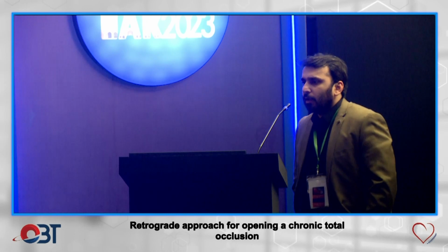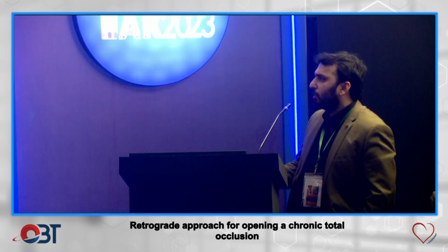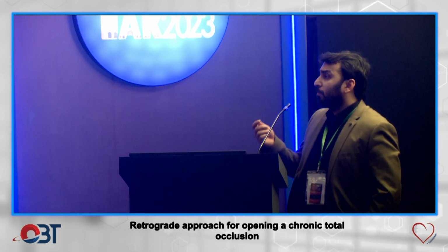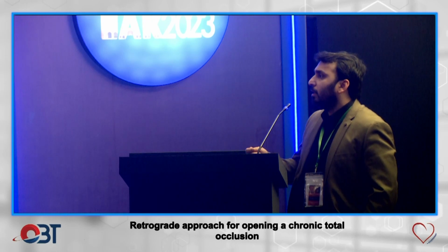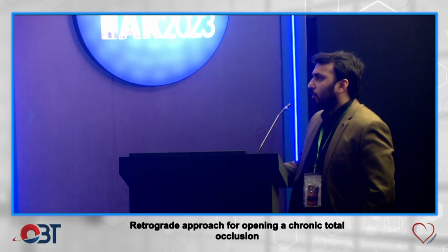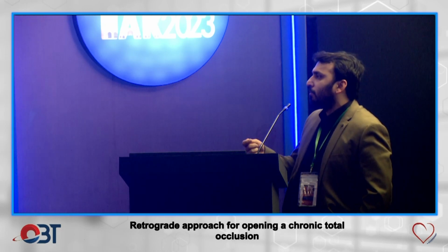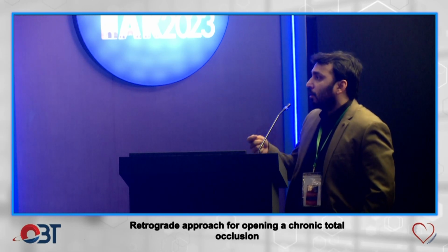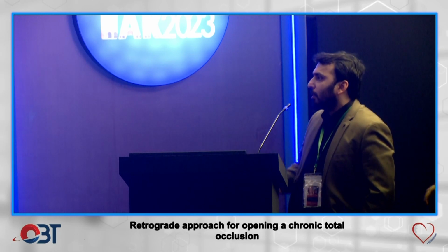There, your microcatheter might have helped you to figure out whether this is intraplaque or extraplaque. Yes, microcatheter. You mean we take a check with the microcatheter to see where the wire is? Yes. But I didn't do it because the Pilot 200 had already developed many planes, so I thought it would make it further worse, and the Gaia wire is a penetrating wire. So there should be less dissection, and let's try with the Gaia wire if it goes antegradely.